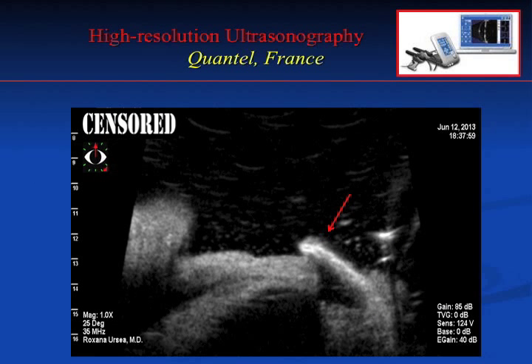So very carefully, I did ultrasound biomicroscopy with her. We do have 2 units in the clinic, and we do have also a Visante. So in this particular patient, as you can see over here, you can see the sclera. I could visualize the whole thickness of the sclera, and this is the beauty of the UBM, because it allows you deeper penetration, and you can see the whole thickness and measure it. And look over here. I don't see almost anything because it's all this empty space practically and significant thinning.